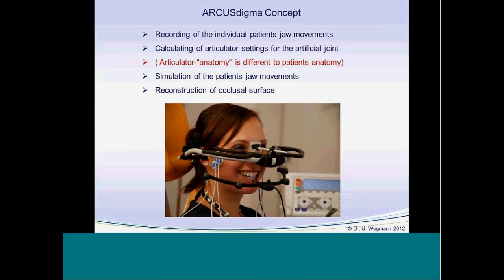We record the real individual patient's jaw movements. We want to simulate the movements, therefore we have to record the movements. From these electronic recordings, we get a lot of data about these jaw movements, and from this data, we can calculate settings for our artificial joint in our articulator.